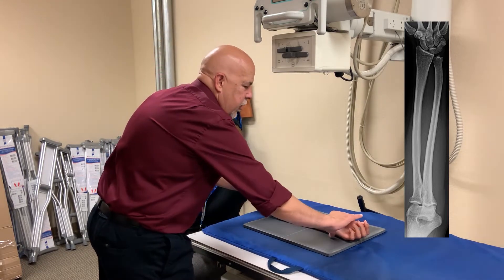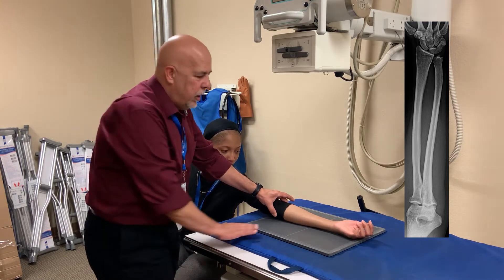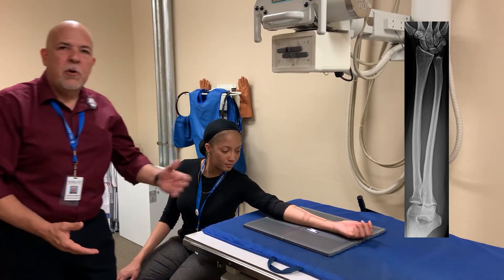Now, you want to make sure that her palm is completely forward, and her shoulder and elbow, and the medial and lateral epicondyles are parallel to the cassette. Make sure your marker is within the light field, and expose your image.